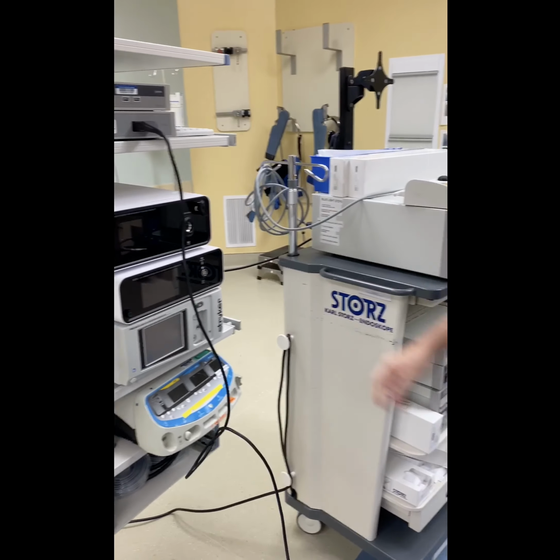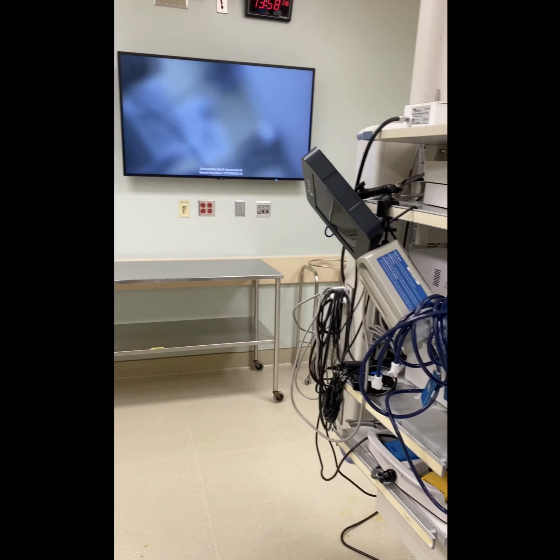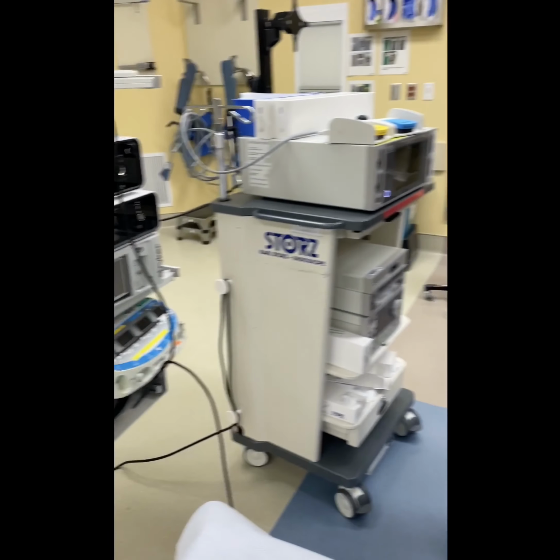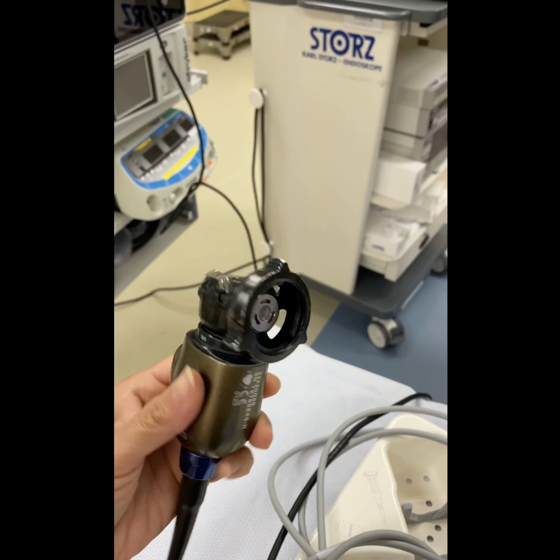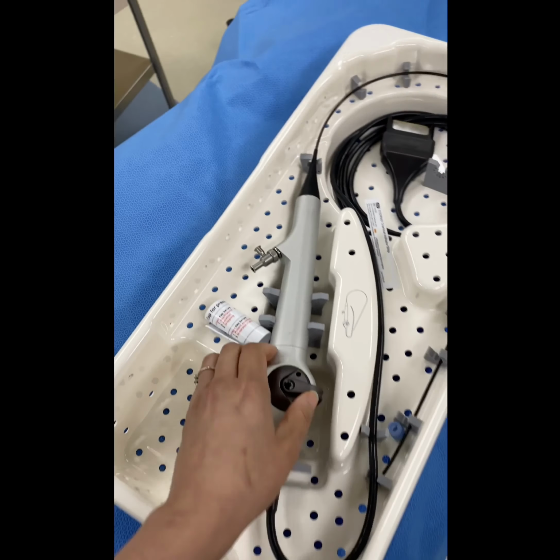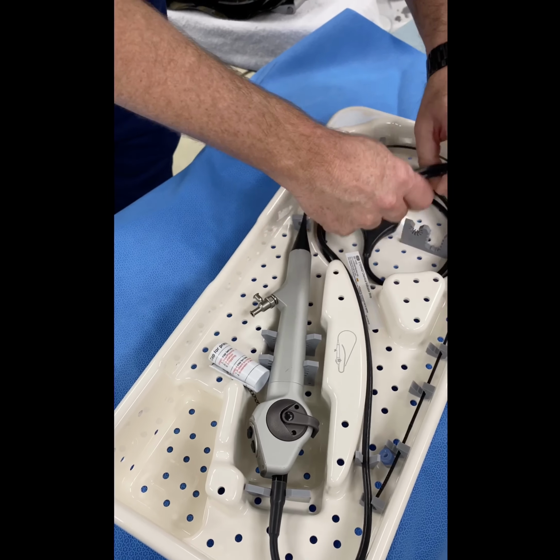This part is when they're just doing regular cysto, and as you can see, the image has come up. You get the full screen image. So now you're doing cysto. Imagine that the cystoscope is attached to this camera head, and all of a sudden the doctor says, okay, I'm ready to use the digital ureteroscope. That's when you pop open this puppy, and we're going to plug in the digital ureteroscope.